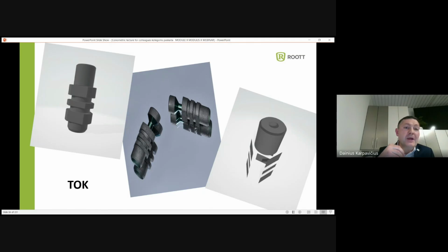You are giving an impression not from the implant, not from the primary abutment, but from the abutment used for crown fixation. So for bridges, it is the most precise impression type. With regular impressions it is impossible to do this, because technically there are discrepancies between details, and these microns can finally influence the passivity of seating of the bridge.